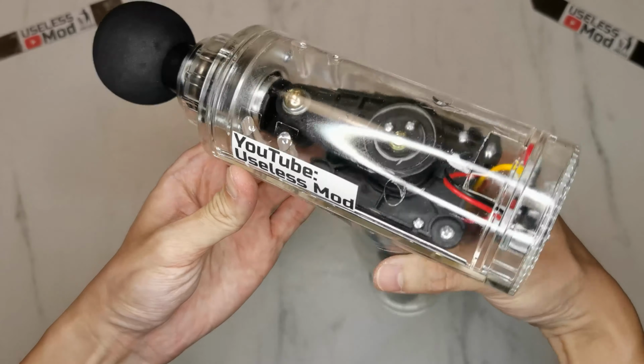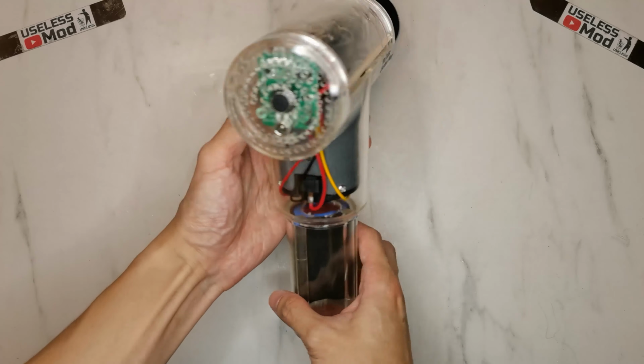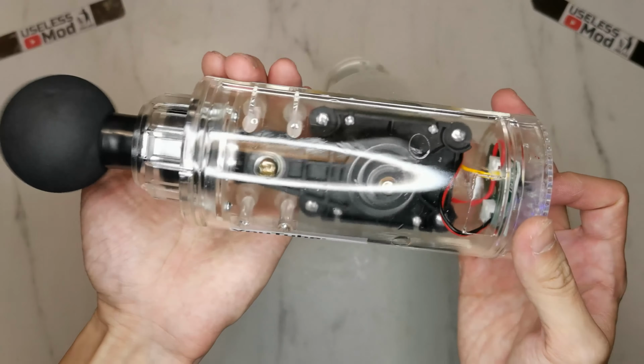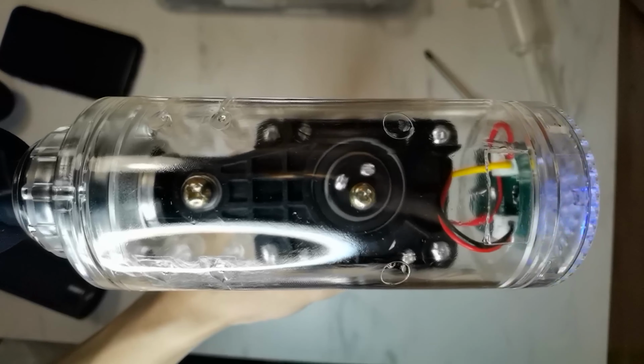Voila! All done. You can see the case is very clear. You can see everything inside. Let's turn it on to see everything's working. Let me show you the slow motion video.